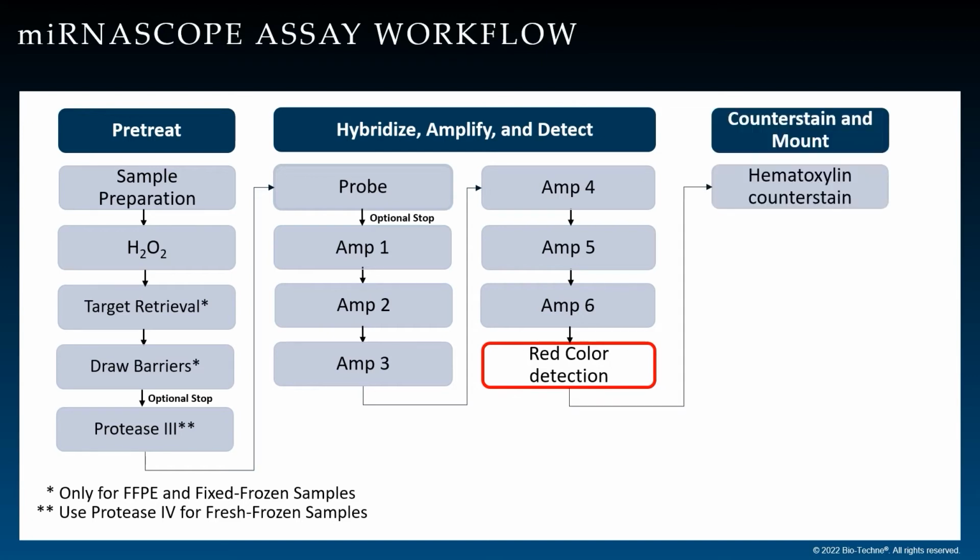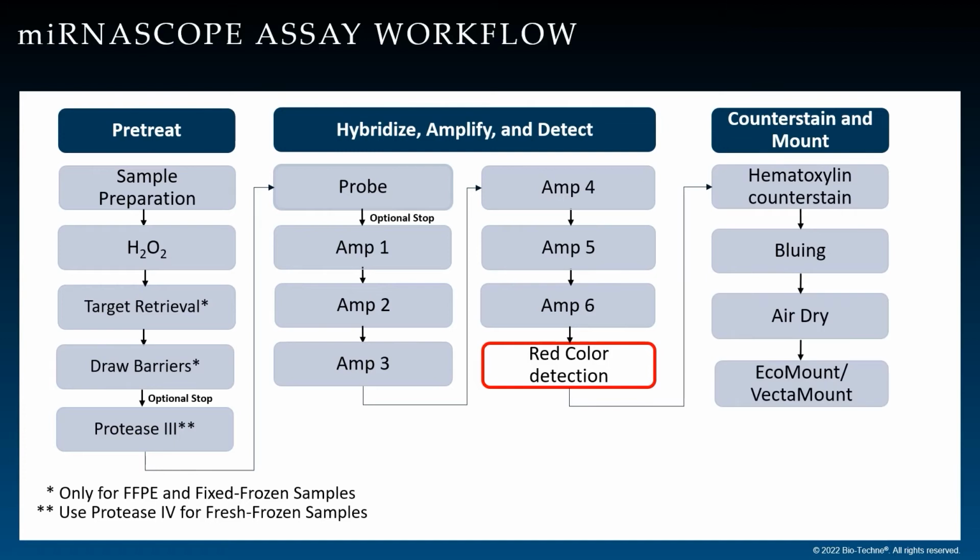The final phase of the miRNAscope workflow consists of nuclear counterstaining with hematoxylin, bluing of the counterstain with dilute ammonia, and mounting. The total runtime for this workflow is approximately 9 hours.